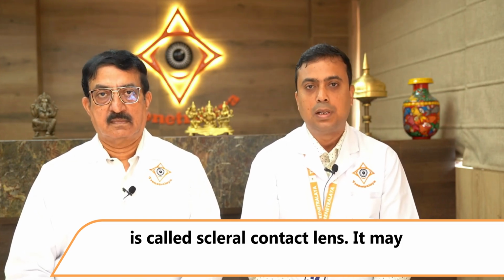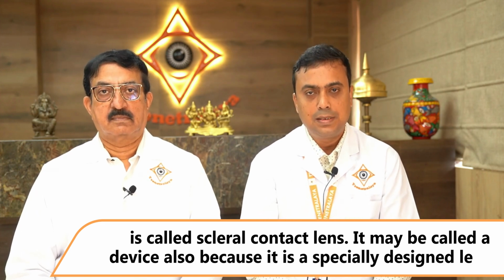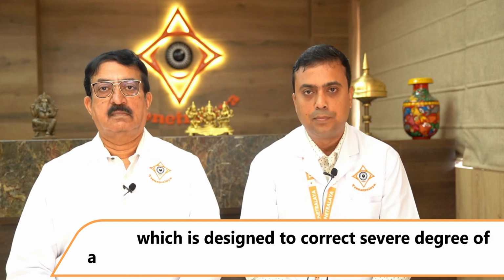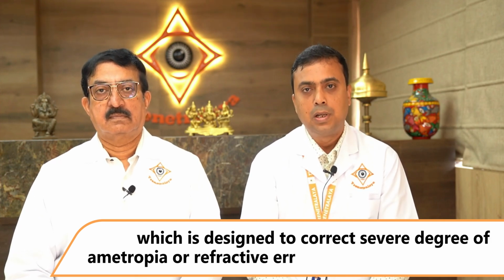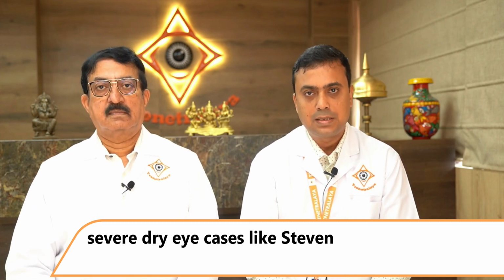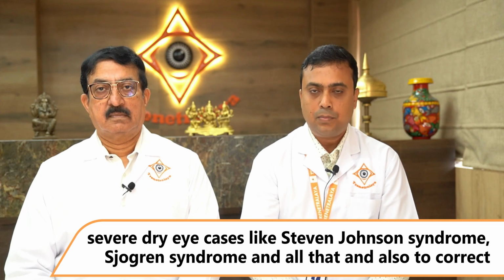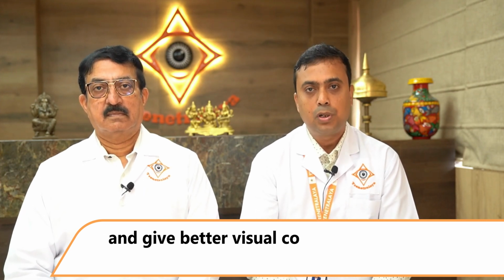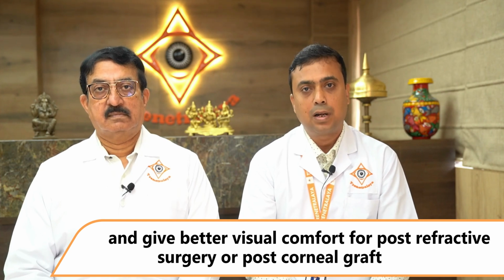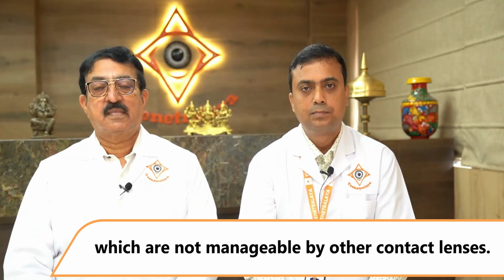It may be called a device also because it is a specially designed lens which is actually designed to correct severe degree of refractive error, high astigmatism, very severe dry eye cases like Steven Johnson syndrome, Sjogren syndrome and all that, and also to correct and give better visual comfort for post-refractive surgery or post-corneal graft surgery cases which are not manageable by other contact lenses.